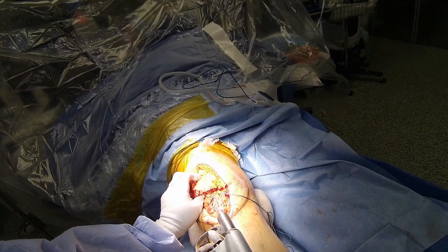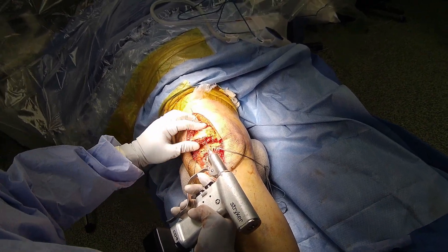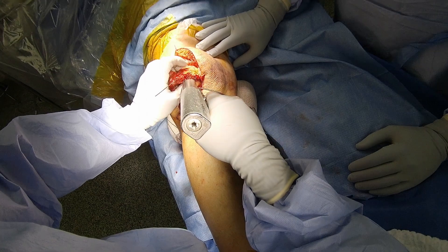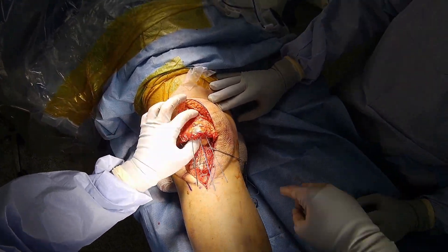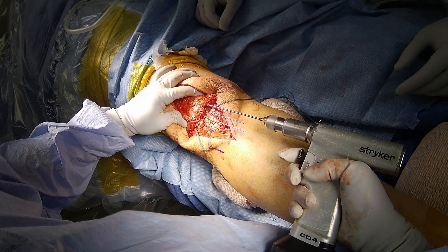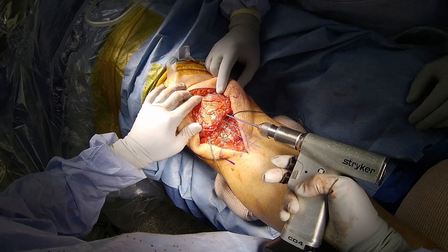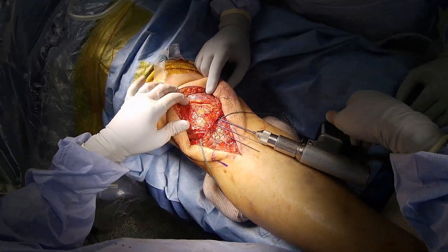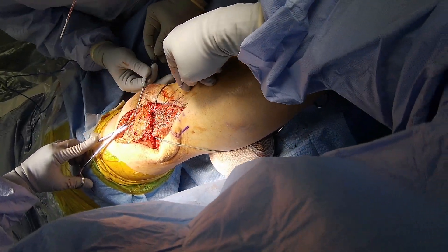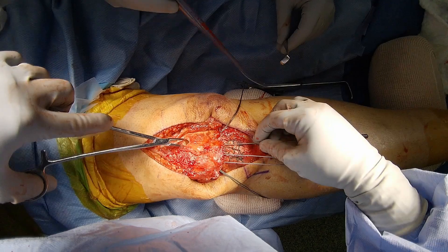The three wires are then drilled through the patella to serve as guides for a cannulated drill bit. My intent is to have them nearly parallel in both AP and lateral planes, approximately evenly spaced in the central aspect of the patella, so they have excellent purchase. I am holding the patella as I drill to help reduce the wiggle of the wires. Once the drill is through the proximal cortex, I cut over the quad tendon to reach the drilled hole and spread the approach with the tonsil. I pull the drill out and insert the Hewson suture passer through the drill hole.